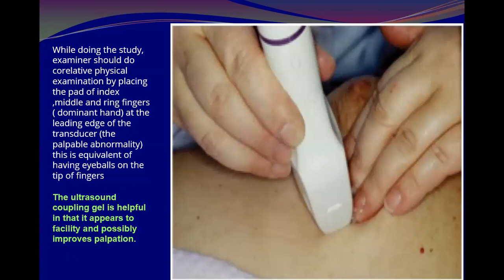Okay. And if she could not palpate it while lying down, let her sit and palpate it. And these are examples here.